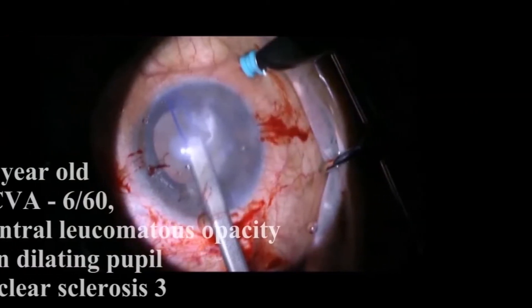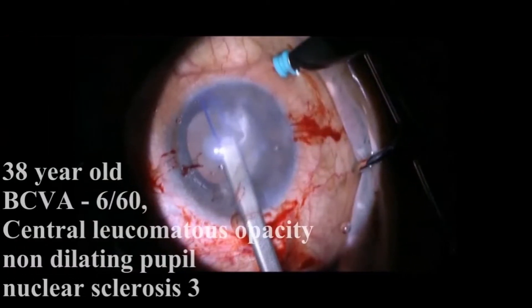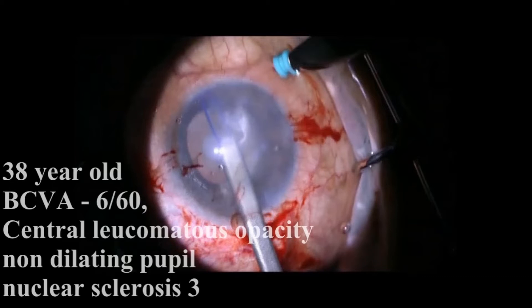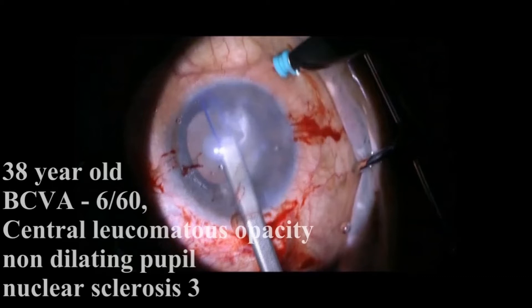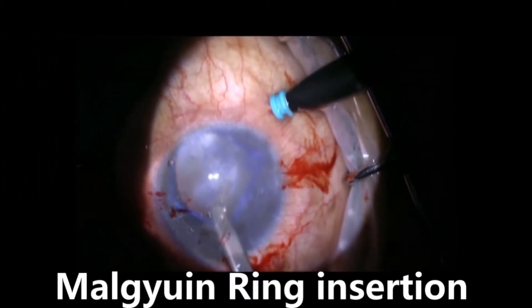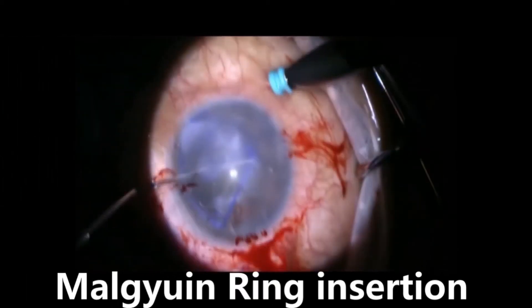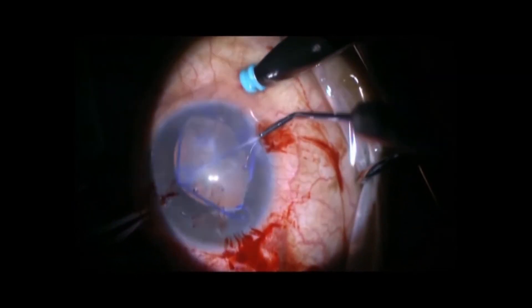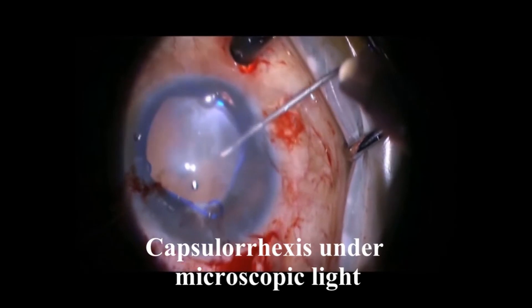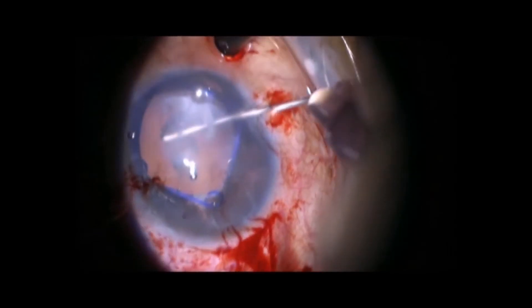The fourth case is a case of herpetic keratouveitis with secondary glaucoma. Due to raised IOP and glaucomatous disc changes, cataract surgery along with Ahmed glaucoma valve implantation was planned. After fixing the chandelier, a Malyugin ring was placed to dilate the pupil.